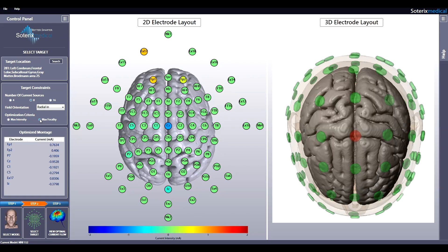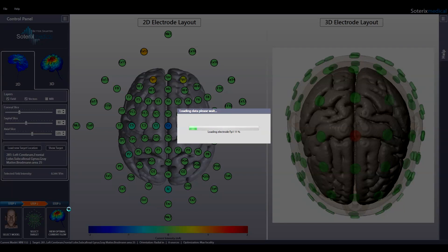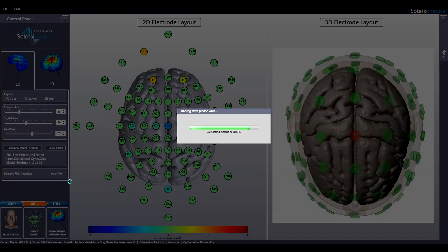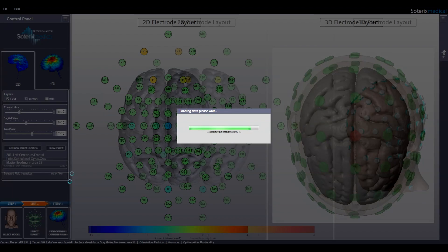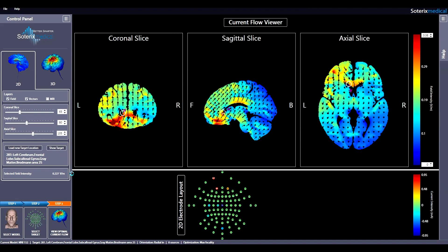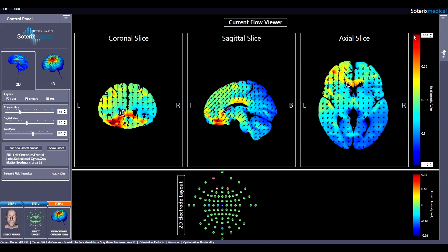Step 3: To show how current flows through the brain, next hit view optimal current flow. Soterics Medical HD Targets will now show you the current flow pattern through the head in both 2D and 3D for the optimized electrode montage. The default view in 2D shows the current flow for 3 different views in false color, with 0 indicating no current and red indicating maximum current with the electric field intensity indicated.